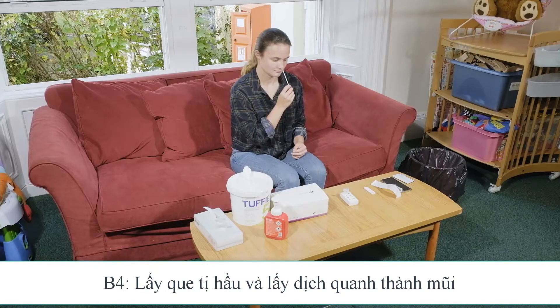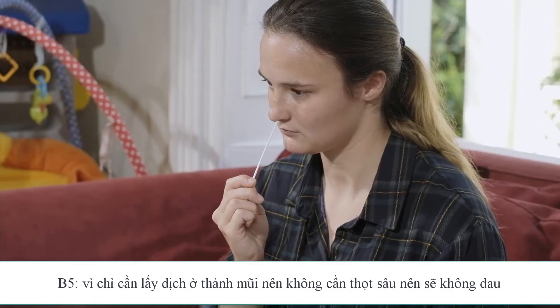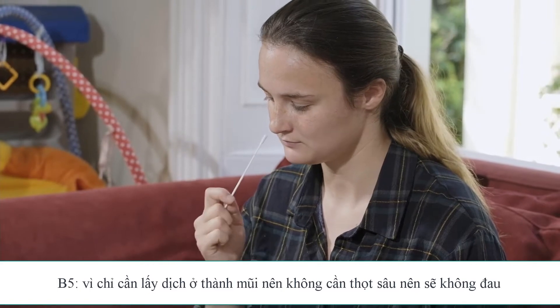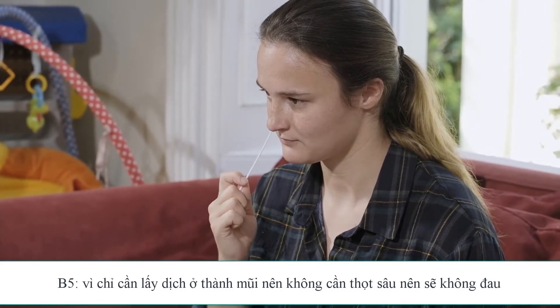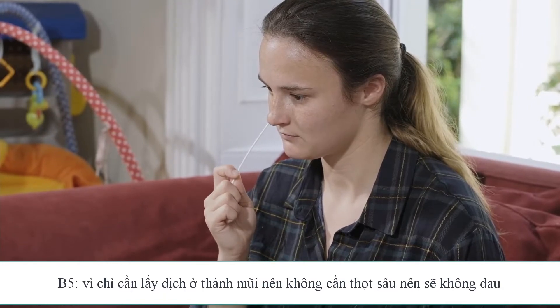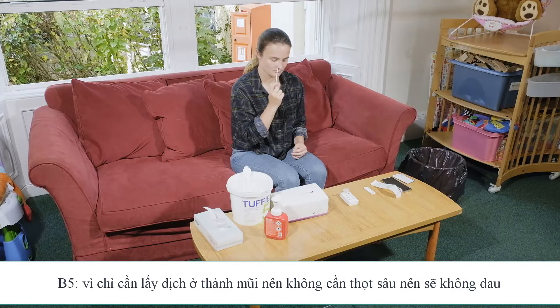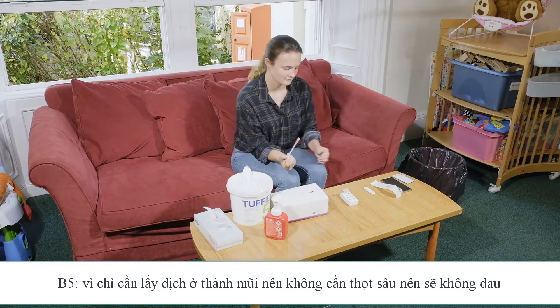Insert the swab approximately 1.5 cm to 2.5 cm into one of your nostrils and rotate it 5 times slowly, pressing firmly against the nasal wall for at least 15 seconds. Repeat this in your other nostril, rotating at least 5 times around the nasal wall again for 15 seconds. You do not need to swab your throat on this test.